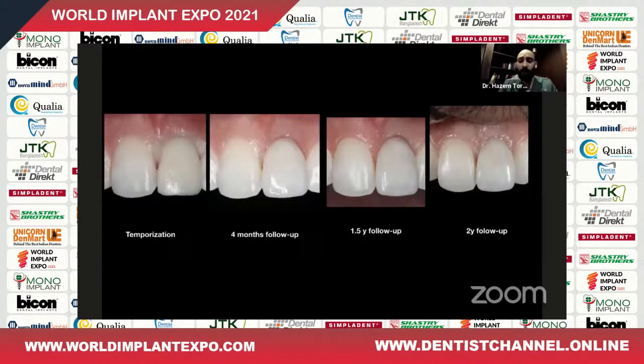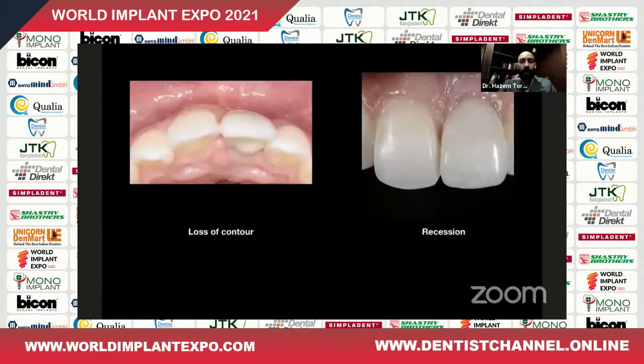Now, this is a summary of how we started with a temporization phase, the 4 months follow-up, the 1.5 year, and the 2 years of follow-up. And you can see how the process of recession is just starting after 1.5 years. This is the loss of the contour that we have. We have 2 problems, loss of contour and recession. We need to solve both problems. This is the way that we dealt with it.